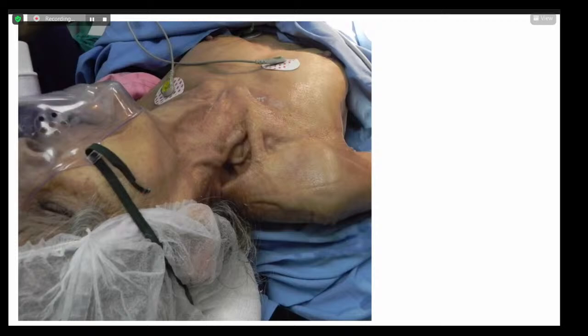What was the question, sir? I just missed it. No, the question is the patient had a vertical clavicle. Okay, sir. So anatomical landmarks are out of question in this case. Exactly, sir. The probe placement is also difficult because this is a hollow supraclavicular fossa and infraclavicular fossa. And the patient is unable to abduct the arm because of a frozen shoulder. So what block would you give? Of course, Surjit, since you are doing the axillary fossa block, probably you would do that in this. Yeah, sir, I'll go for it.